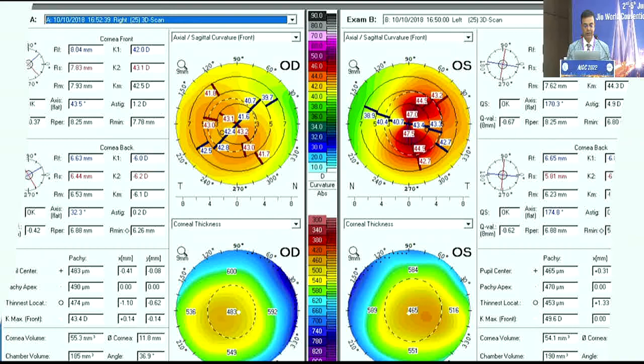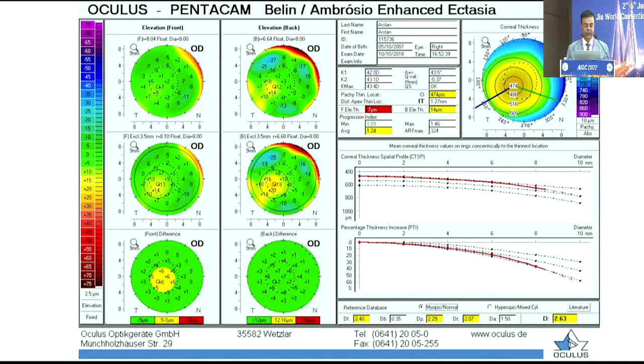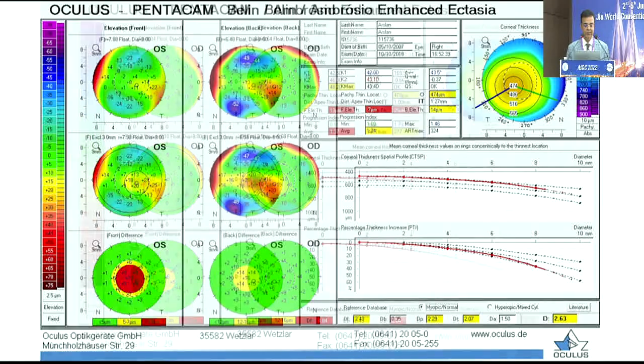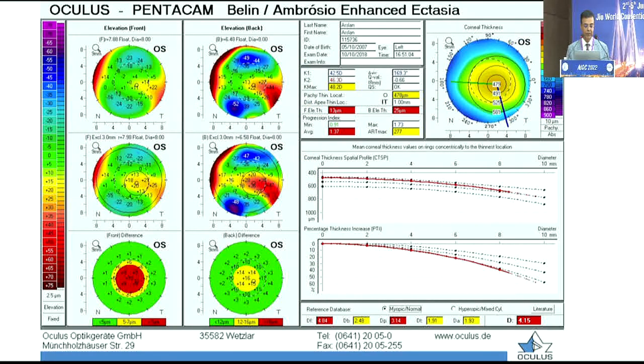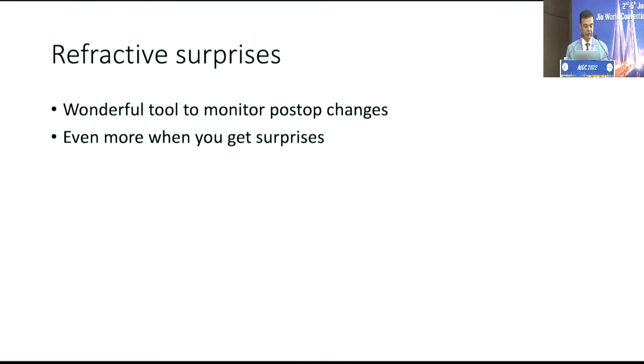So this was a patient where you can see that in the left eye there was a skew with the steepening, and we picked it up on the Belin maps as well. There were anterior changes on the cornea on the front anterior maps, and this was on the left eye, which was obviously showing up more changes on the front surface than on the back. And when we went ahead and did the epithelium maps, you can see that the right eye and the left eye show a clear situation where there is a possible ectasia because of the thinning over the area of the apex. And here you can see the compensatory hypertrophy instead. You're not seeing much thinning except maybe a small island here. So both these eyes are definitely not healthy corneas. They are both suspect corneas, and this really helps you in making doubly sure if you are picking up something, and if you're not picking up anything, then it kind of gives you some room for doing some other surgery.